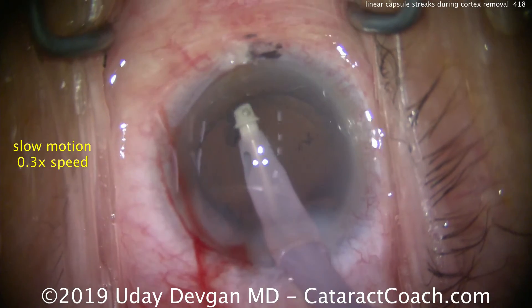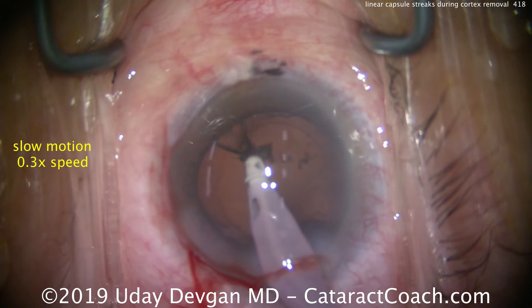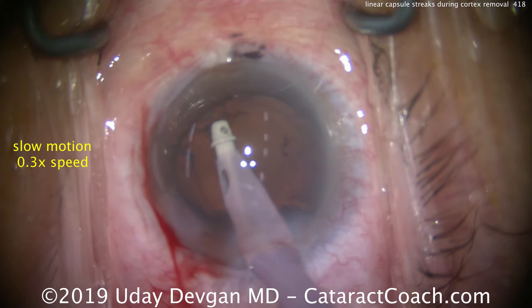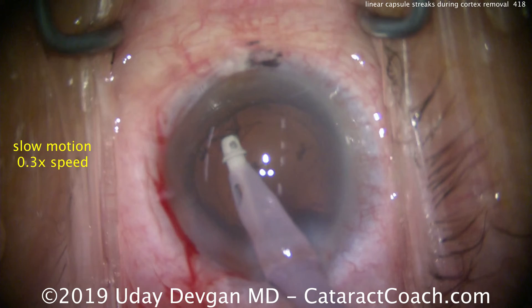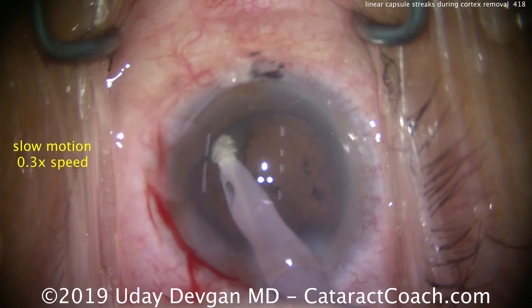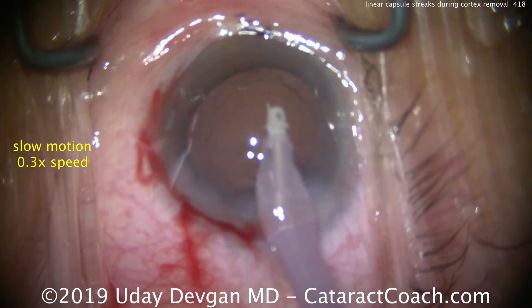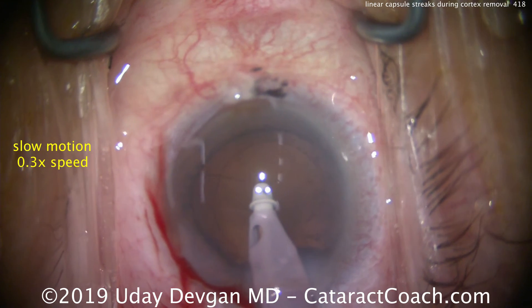Let's go back to that one section and watch it in slow motion. As we grab here — this is at one-third speed — we see some linear lines, and I just reflexively back-flush out. You don't want to keep pulling. Now I'm sure it's okay, we try again, and there's another linear line there. Let's just let go — it's probably just cortex. We'll go back again and be very gentle. Make sure you know how to use that back-flush on your IA tip; it tends to be a foot-pedal kick to the left, but it can vary from machine to machine, and you can program it differently as well.